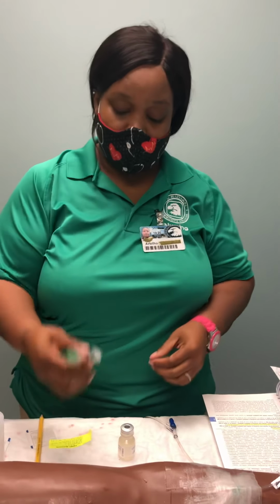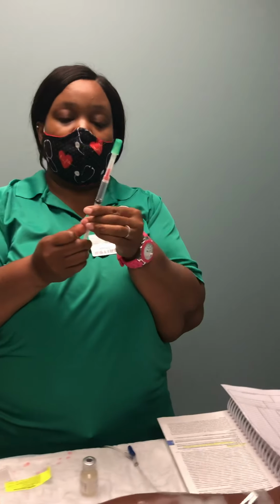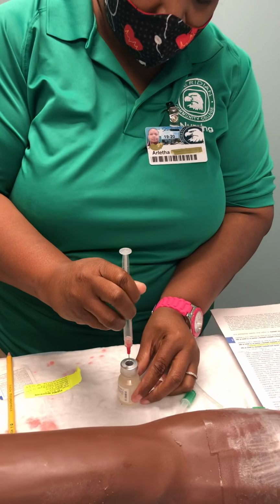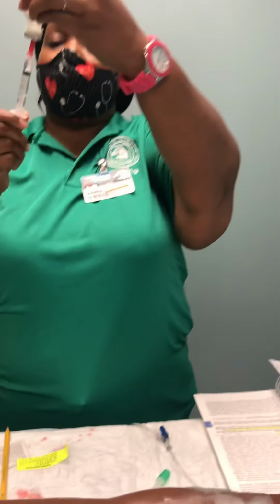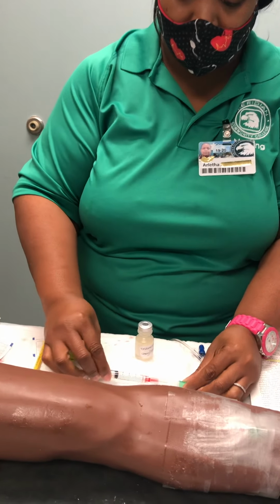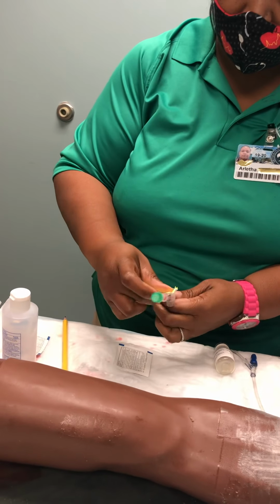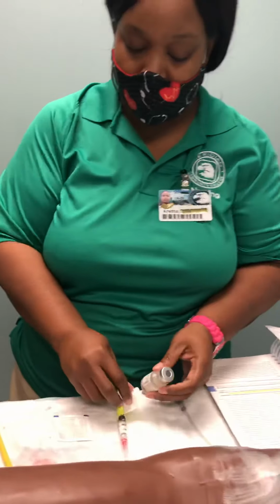Okay, I am going to pull back 2 milliliters of air on my syringe, and I am going to go in, flush the air, and pull back 2 milliliters of solution of the medication. Okay, and then I am going to close that back up, put my label on, and I am ready to go see my patient.